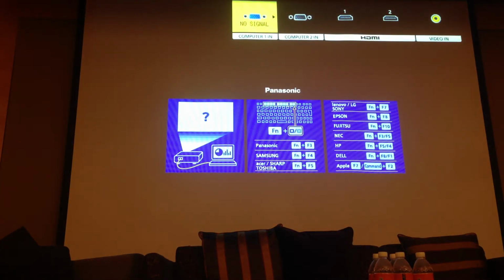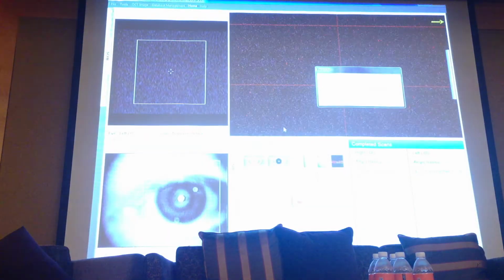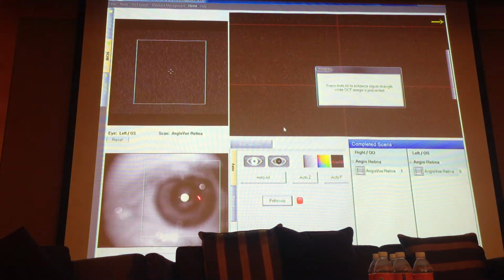Okay, so should we connect it? Yeah. Shall I just do it?